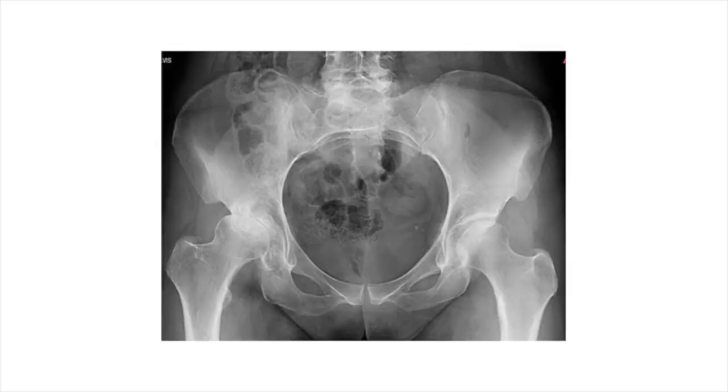The idea behind today's video is trying to show what hip arthritis looks like. For an orthopedic surgeon, the best look at hip arthritis is with a simple x-ray of the pelvis, and that's what we're looking at here.